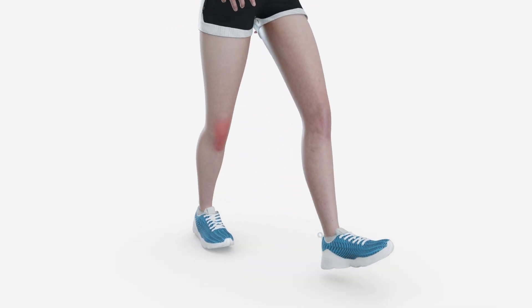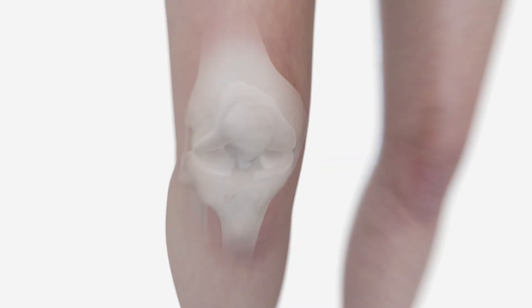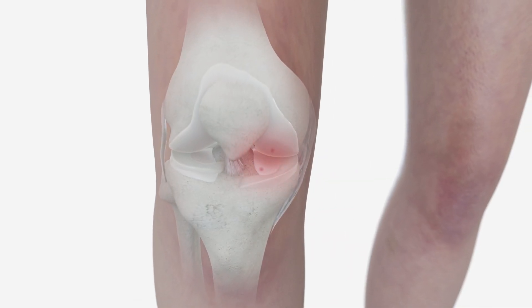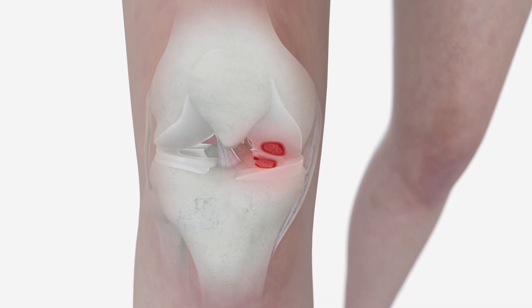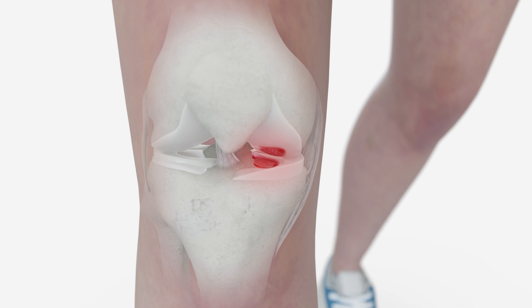Knee osteoarthritis, known as knee OA, is a progressive disease in which patients commonly experience pain while weight-bearing during walking. The pain results from compression of the damaged joint structures.